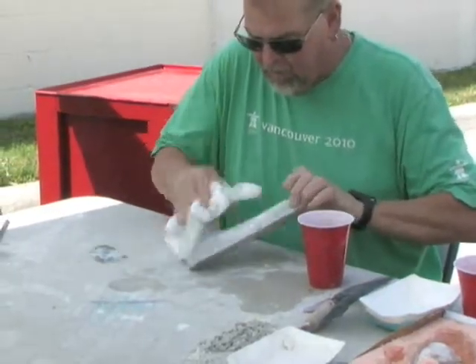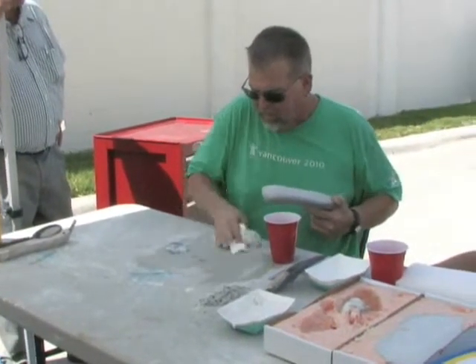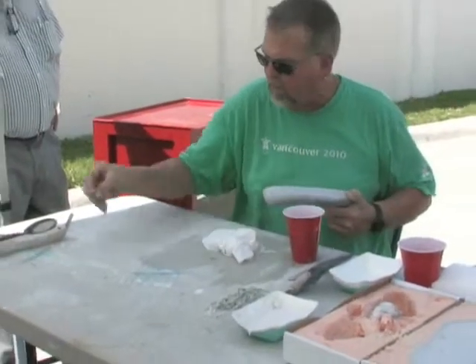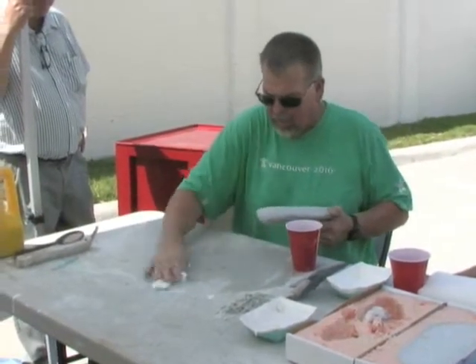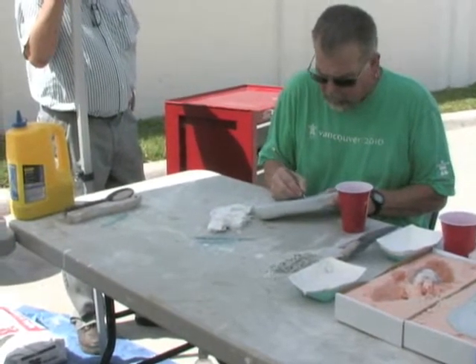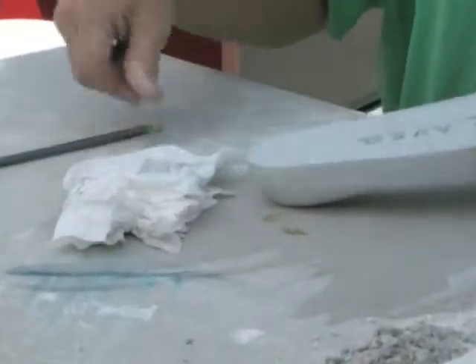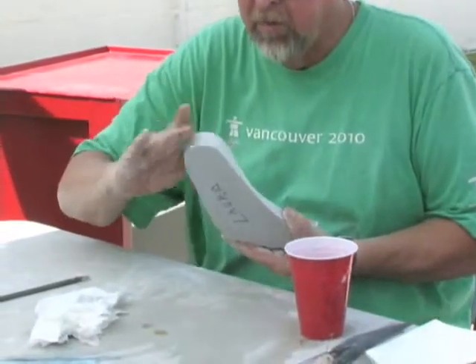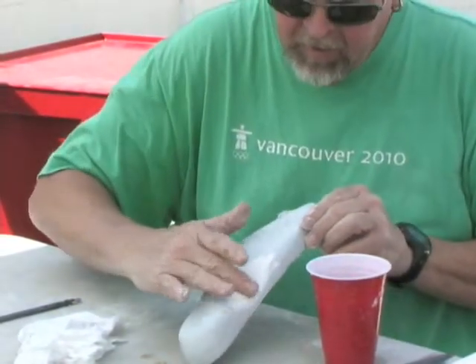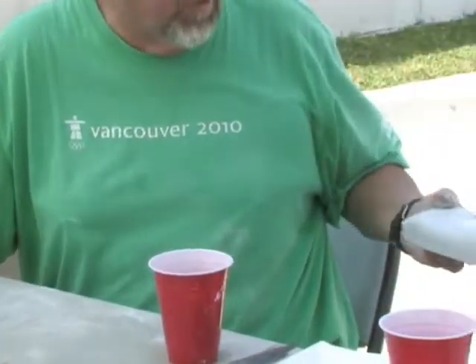I just kind of check it out, clean off my sandpaper — you can reuse it, it doesn't go bad quickly. I definitely want to put her name on it so we know whose it belongs to. I feel across this direction and this direction and see if that feels smooth enough.